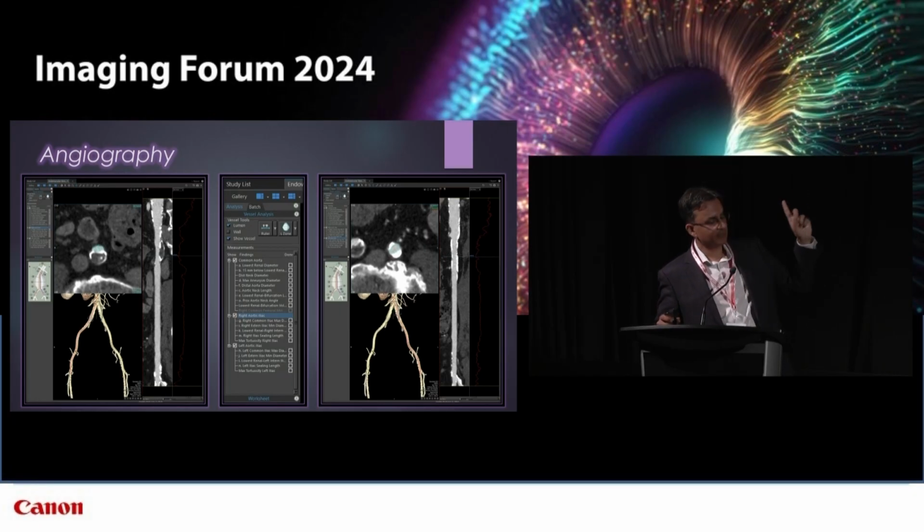And I should add, actually, the other part of this that's really wonderful is the ability to save snapshots at any stage of this segmentation. So we've actually got our technologists, as the patients get off the table, saving snapshots for us, so that as radiologists, in terms of decreasing our involvement in the segmentation, we can really start off at this point and really look at that relevant luminal diameter to go straight to the report.